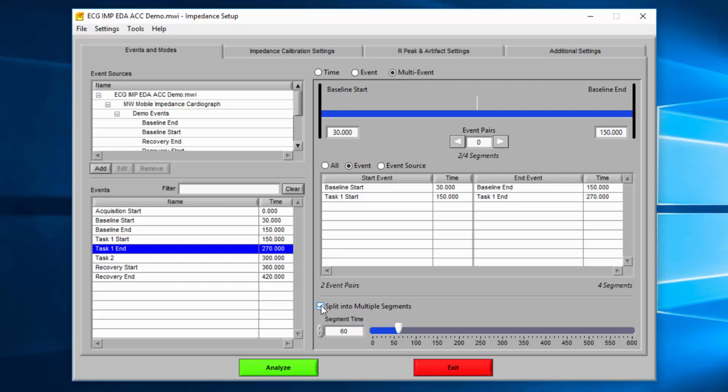For more information on how to use these various modes of operation, see the online manuals, search our knowledge base, or browse our video library for additional content.